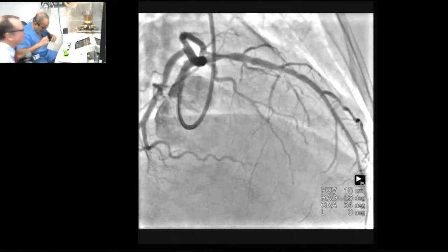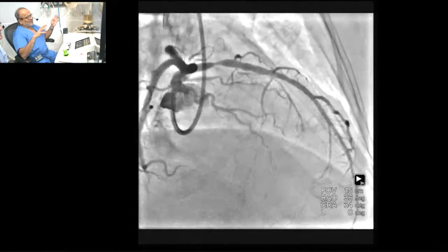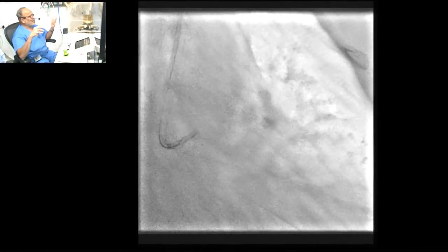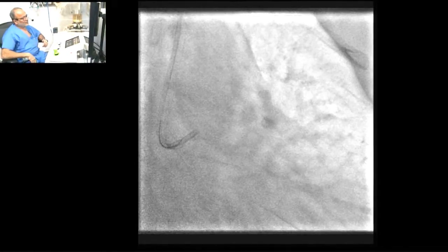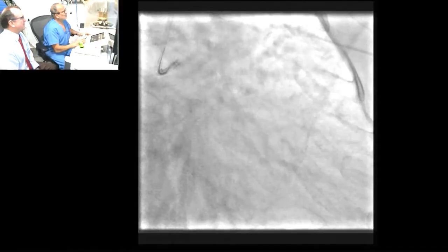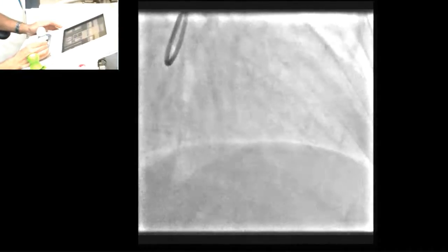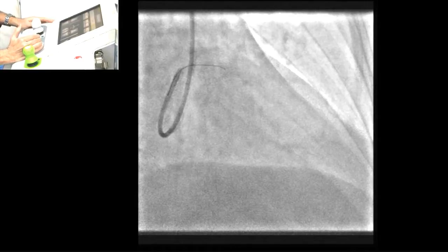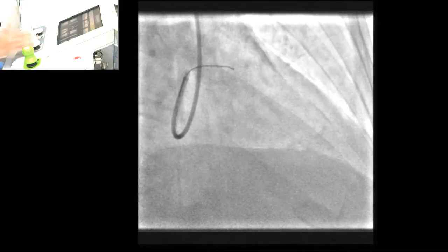Are you all set? Yes. Go to AP caudal — that is what I want to show the young guys. I want to enter the LAD; that's why. Go to RAO caudal. Enable all. I am using the wire scout. Just go to RAO caudal. I am in the LAD now. You can take the best view now.